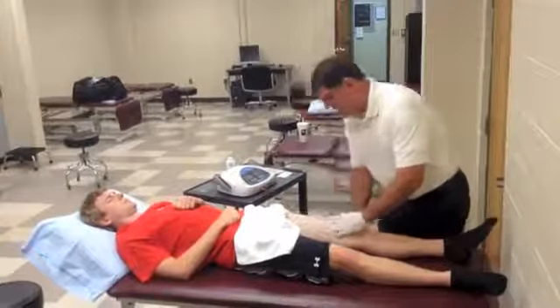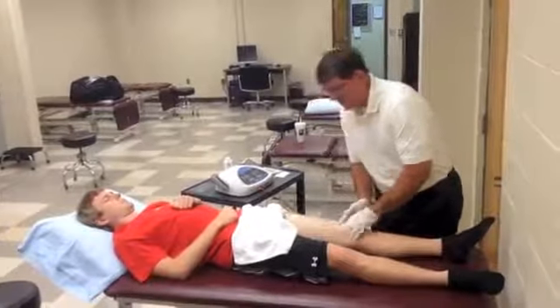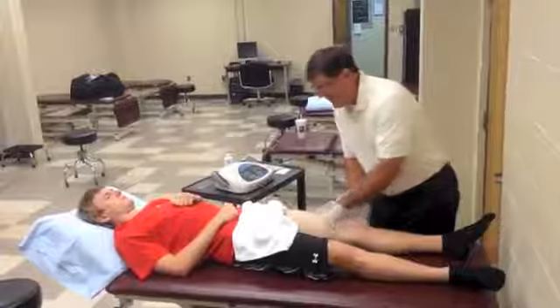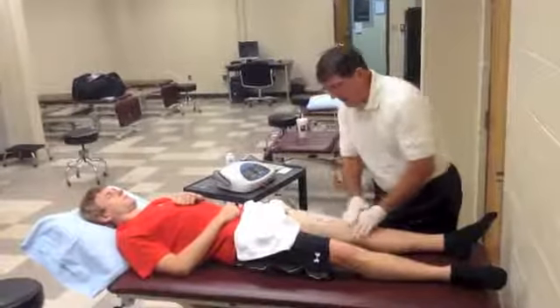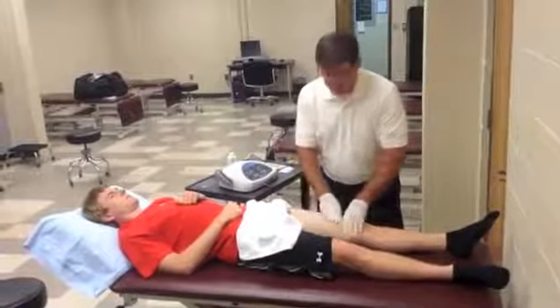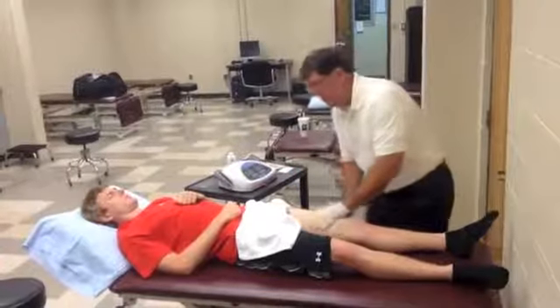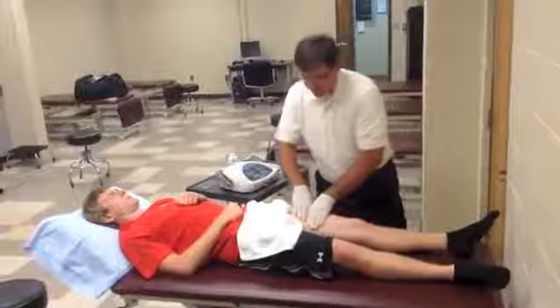But the big point is that this allows the clinician to become involved in the situation, allows you to feel for areas of tenderness, adhesion, edema formation, and this technique is very good at helping to remove those, both from the effect of the electrical fields as well as from the actual pressure that you apply in the direction of return circulation.